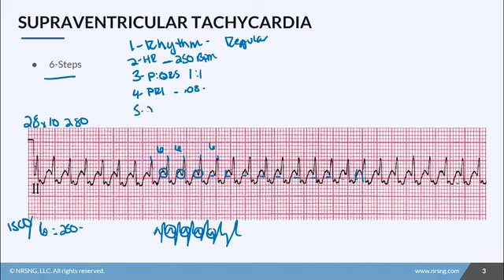Same with the QRS complex — that's how long it takes for the electricity to travel through the ventricles. Here we have one box, so 0.04 seconds. Again, because it's beating so fast, the electricity is going to take a lot less time. In step six, we identify our rhythm, which is SVT.